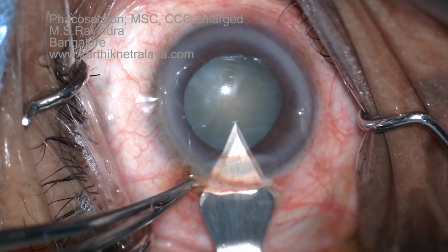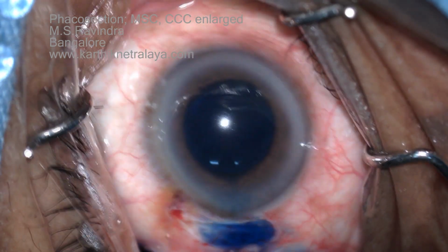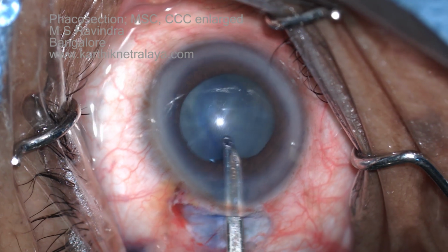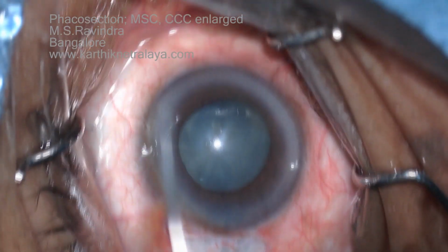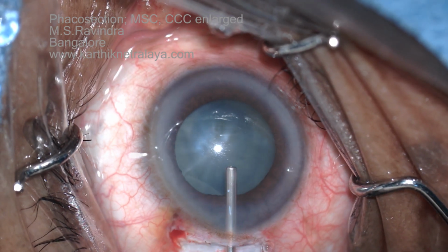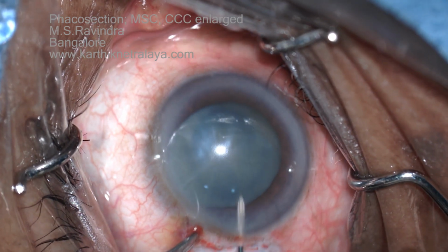A 3 mm long entry is made at the anterior end of the tunnel to enter the chamber. Under the air, Trypan blue is injected. There is a certain amount of floppy iris in the eye. Visco is injected into the anterior chamber to deepen it.